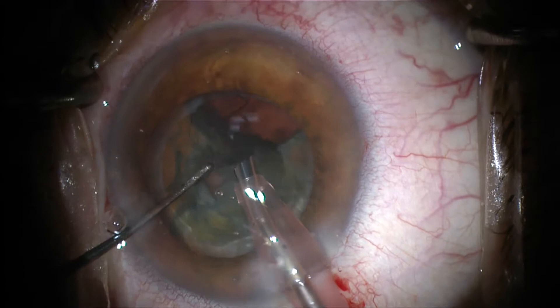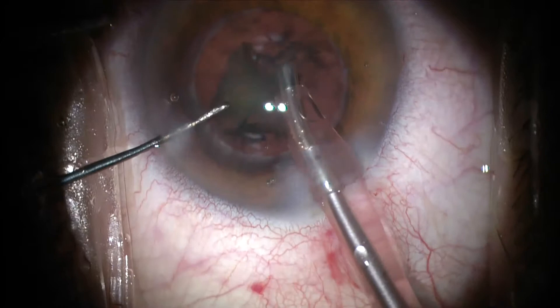This part is removing the cortex from the lens, so the secret here is to keep the lens capsule intact.